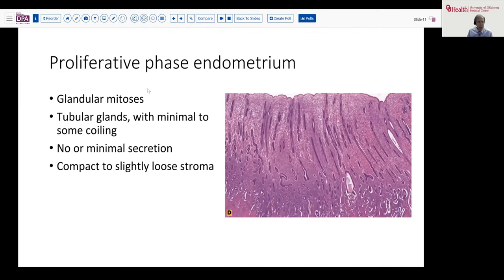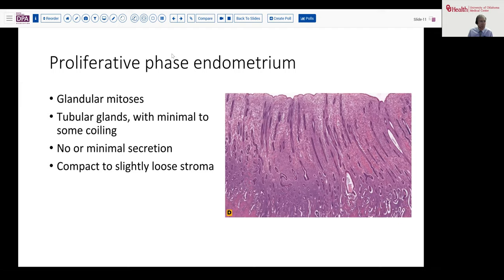I'm going to start with the proliferative stage. After menses have concluded, generally around days five or six of the cycle, the proliferative phase begins and can last about two weeks. Key features that should be seen at this stage are mitotic figures in the glands, and the glands tend to be quite tubular with occasional coiling or minimal changes. We have the proliferative glands and stroma, but we also have residual endometrial basalis. There is minimal dilatation or secretion within the lumina of these glands.